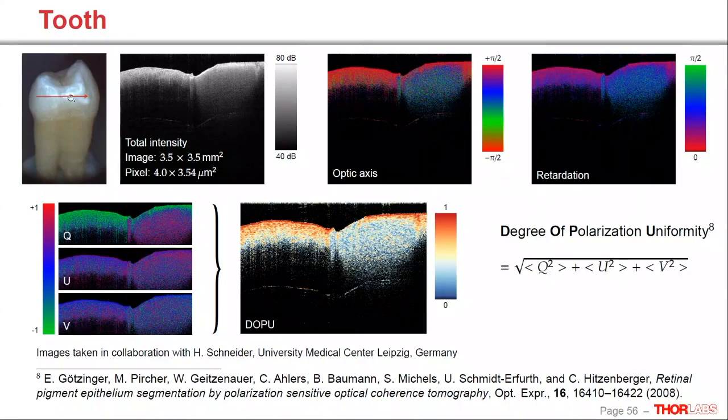And then we have the regions where bacteria have, well, eaten away the tooth, and the body is trying to remineralize that. But this remineralization process is not getting back the ordered structure. And the structure is depolarizing.